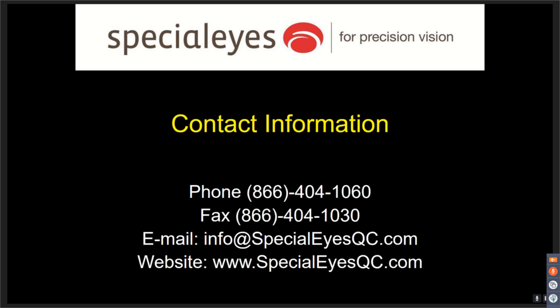I haven't seen anything about the offset optics, although now that I have you here, can I ask you a question that I think would probably be directed at you? Someone asked, what's the typical cost of a lens and the typical retail price that you would charge a patient? Sure, great question. The lens is $40 per lens. The majority of practitioners, due to the custom nature of the lens, replace it on a quarterly replacement, every 3 months.